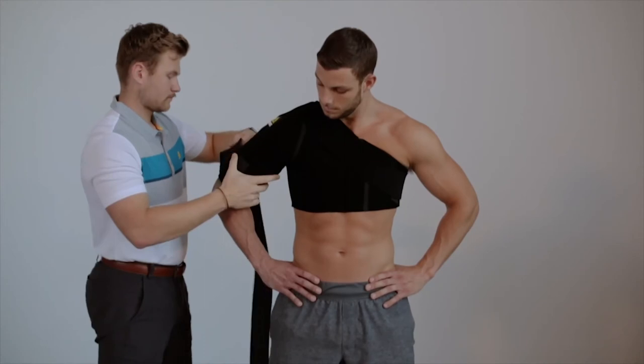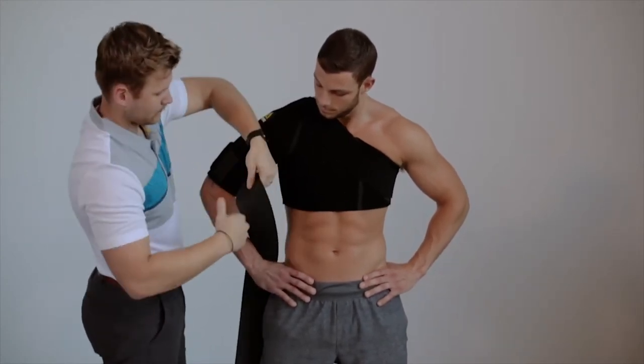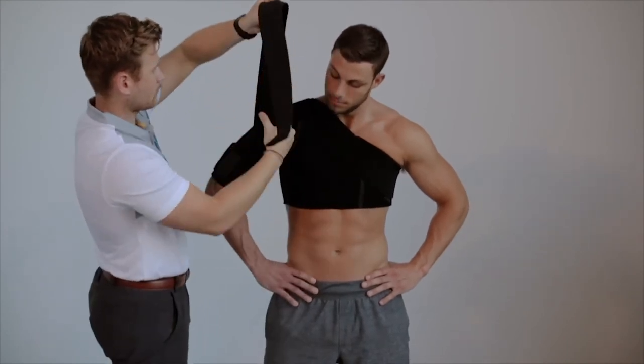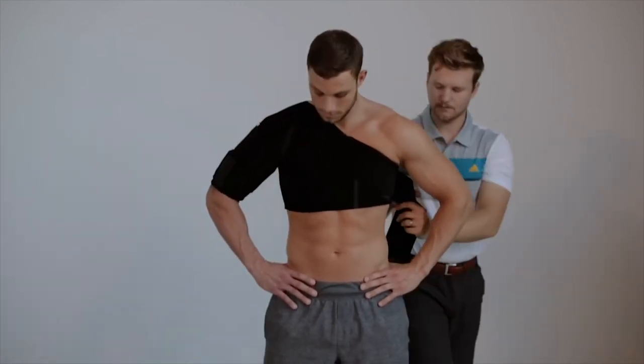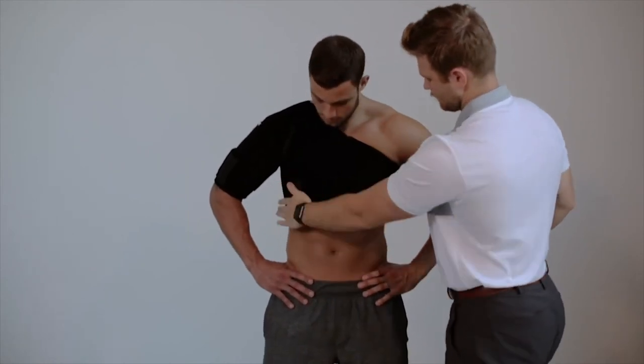Pull Strap B superiorly and laterally, just distal to the acromion process. Bring the strap across the back and around to the front of the chest. Cut the strap to length and secure with hook and loop closure. Finish the wrap, then assess for the desired level of stability and mobility, adjusting as needed.